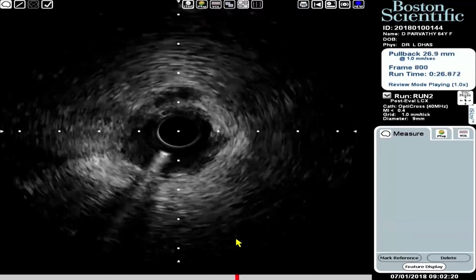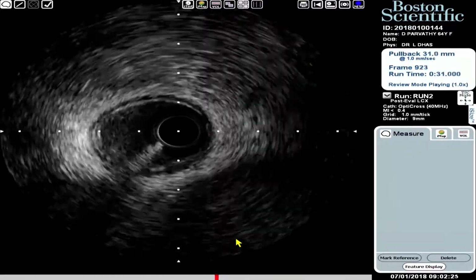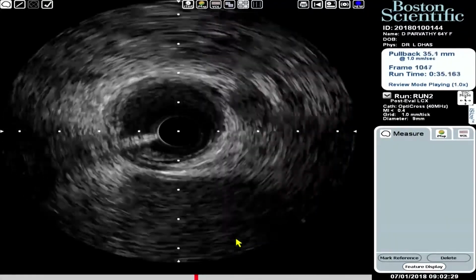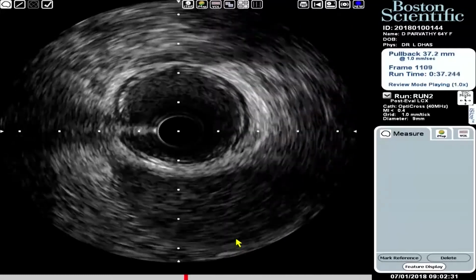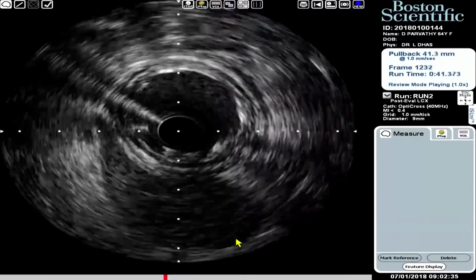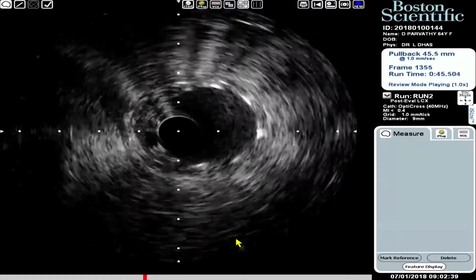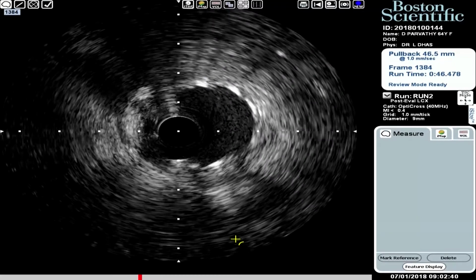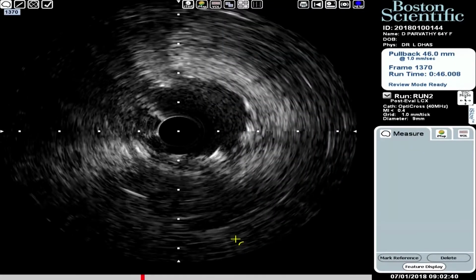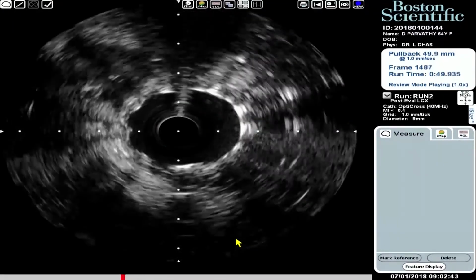So just this well expanded stent, and you just have to see the proximal zone, and it is landed in a good area. So no dissection again. And you can see the great cardiac vein at the 6 o'clock position here. IVUS doesn't have a rotational orientation, so previously it was in the 7 o'clock position and it is in the 6 o'clock position now. So now we can see the distal stent, again no proximal stent, no dissection distally, well expanded.